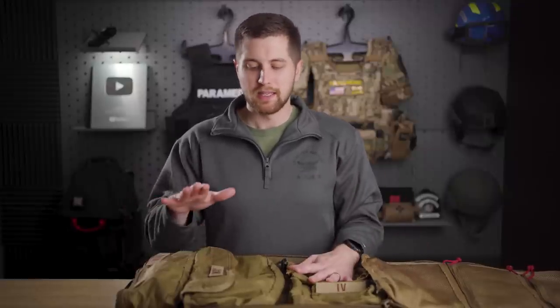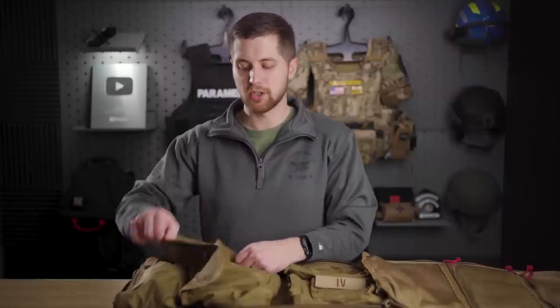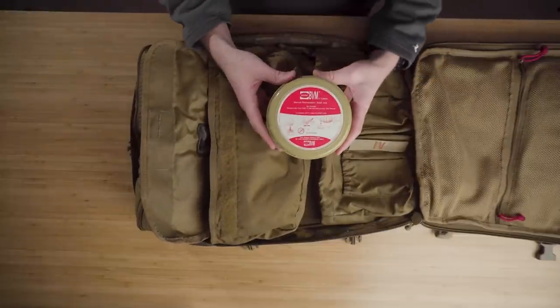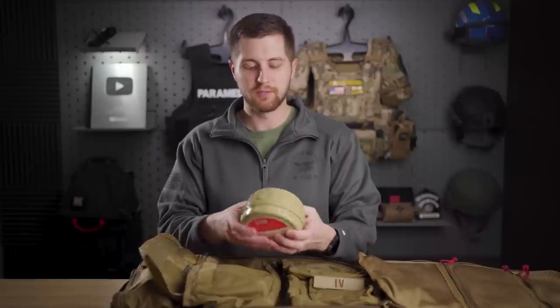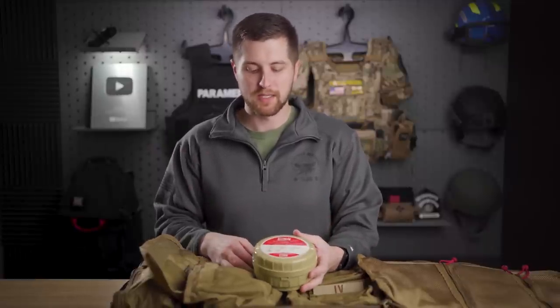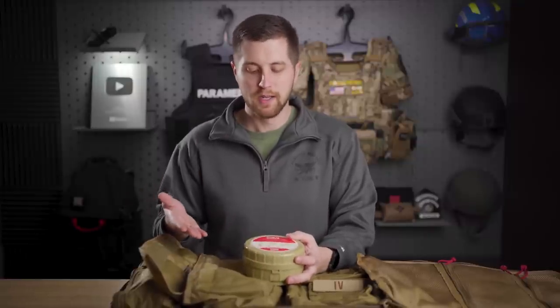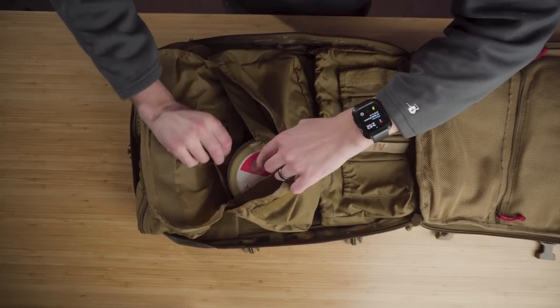Moving on to the airway kit. Before, I was carrying everything from size 2 ET tubes up to a size 8, but I've found I'm never going to use those in the tactical environment — RSI can happen later if needed. The only airway interventions I'll do on scene: first, bag-valve-mask respirations. This is the Micro BVM. You open it up, it pops up into an adult-size BVM. It also has an O2 reservoir if you get somewhere with a tank.